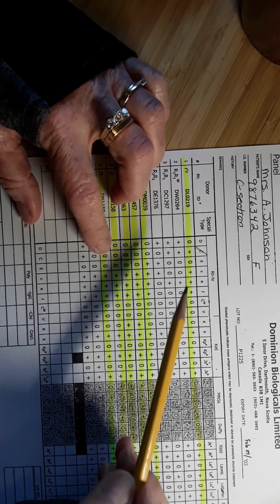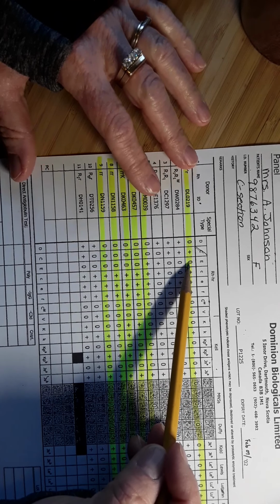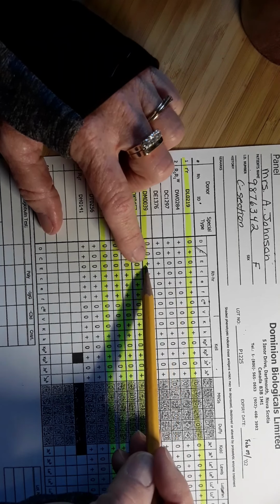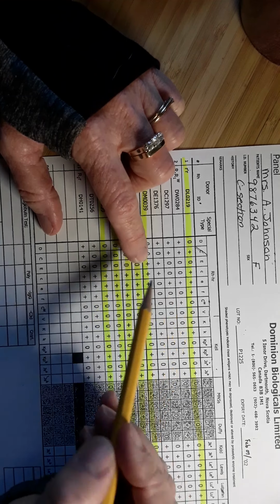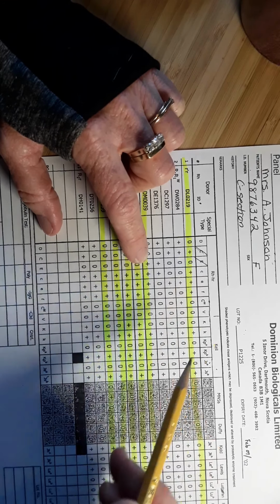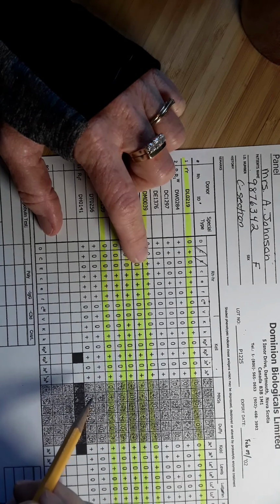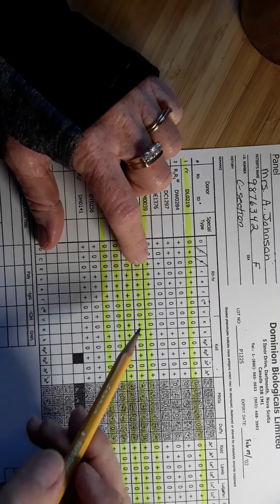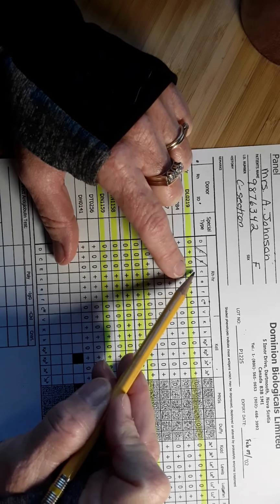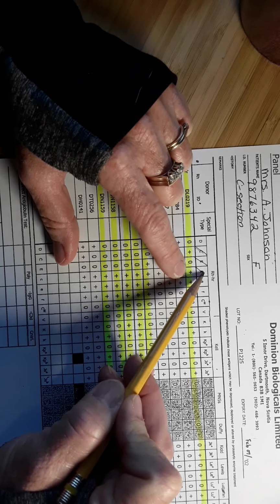On to big E. Looking at the highlighted rows, these are rows where patient's plasma did not react. I have an E positive cell here that did not react with my patient's plasma. So I have some evidence that the patient's plasma does not contain an anti-big E. The little c column. I've got a little c positive cell here that did not react with my patient's plasma, and I put a slash across little c.